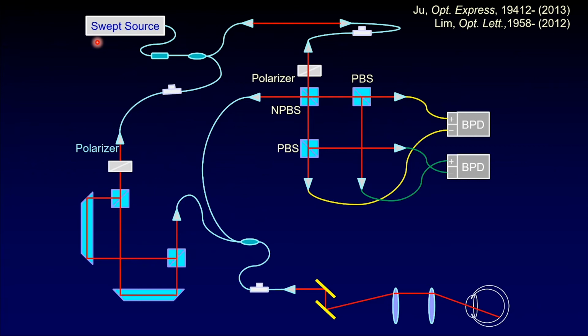Means using the broadband light source, and when it is detected, we resolve it into the wavelength spectrum. But a swept source OCT is not. It uses a scanning laser. At a single time instance, it's lasing a single wavelength. But this lasing wavelength scans quite rapidly, like 100 kilohertz repetition.